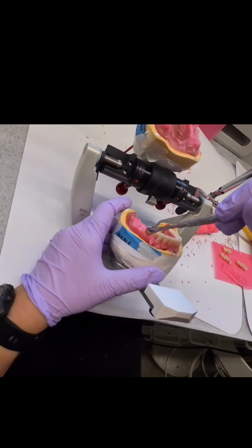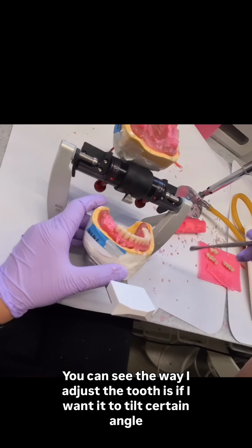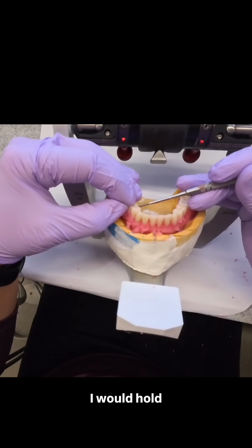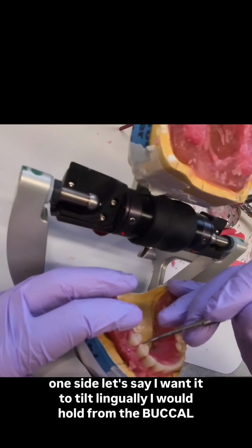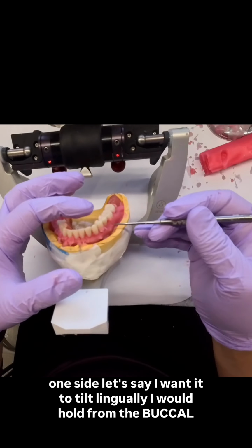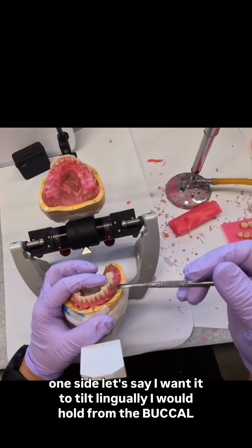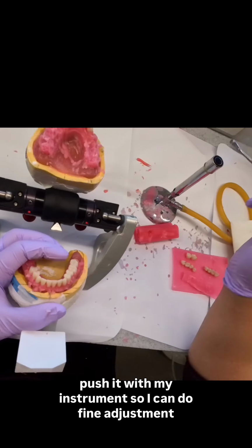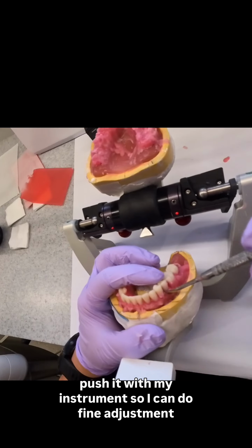Okay. You can see the way I adjust the tooth is, if I want it to tilt a certain angle, I would hold one side. Let's say I want it to tilt lingually, I would hold from the buccal and push it with my instrument so I can do a fine adjustment.